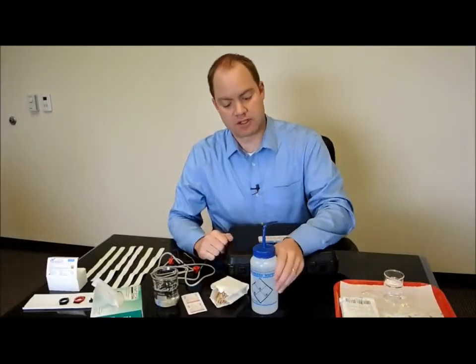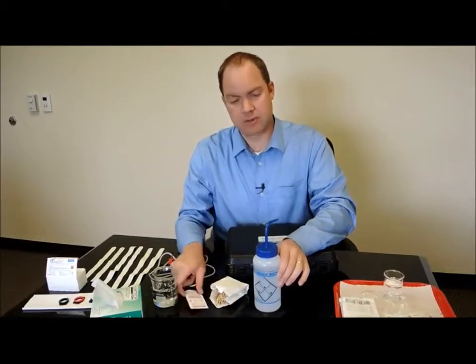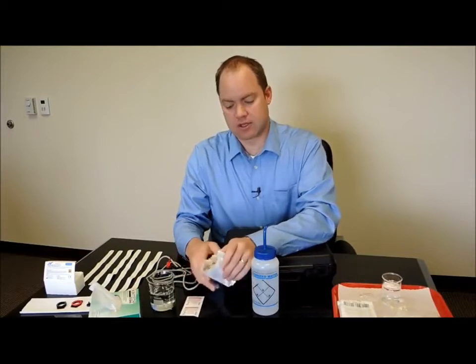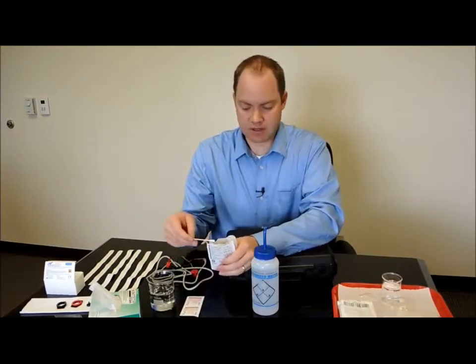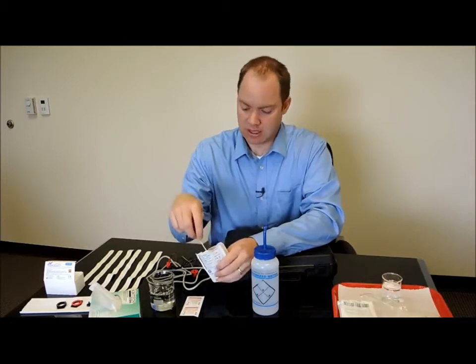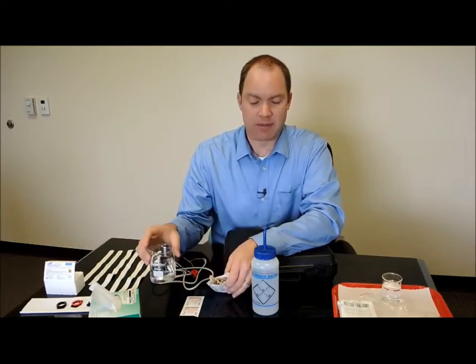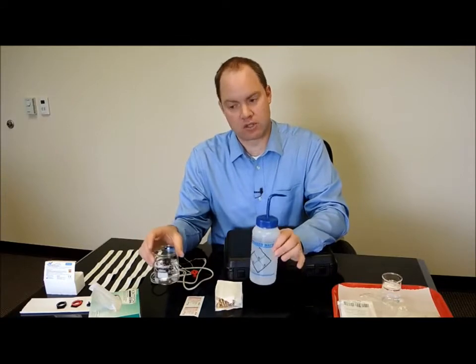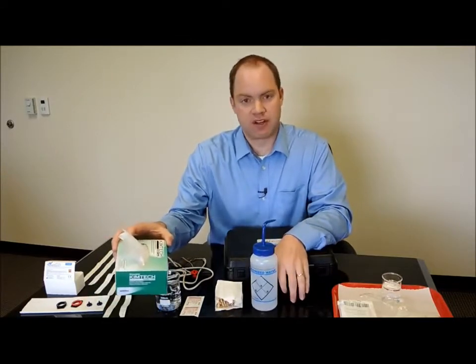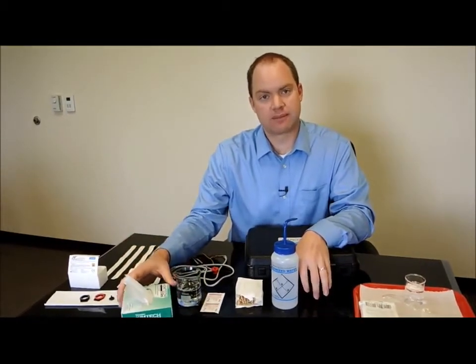Other items that you'll need to provide on your own is some DI water, some alcohol prep pads, some small applicator cotton swabs, DI water, maybe you can use either a beaker or a squirt bottle, either way, and some Kim wipes or some lint-free tissue to help dry the arm as you clean it.